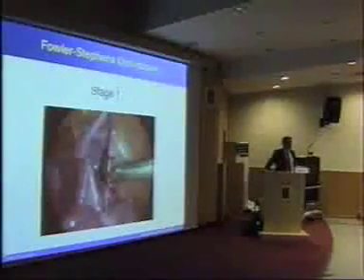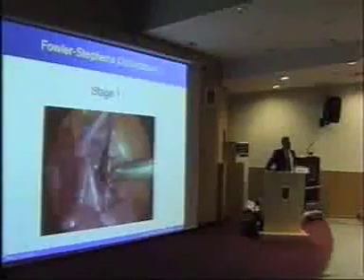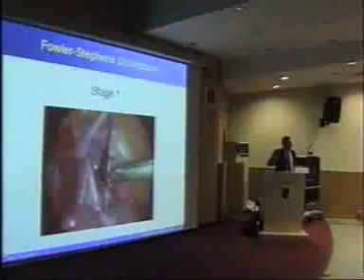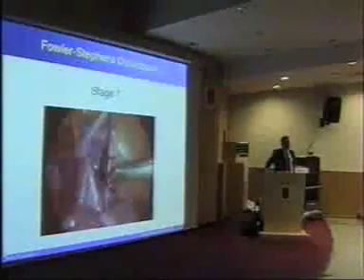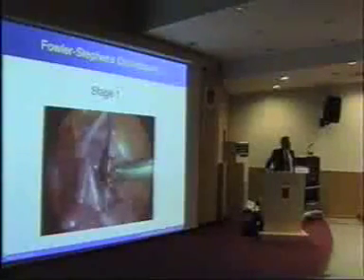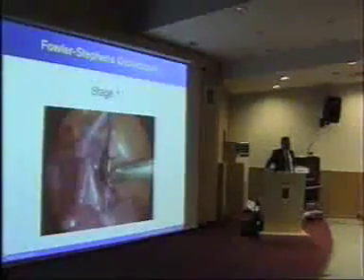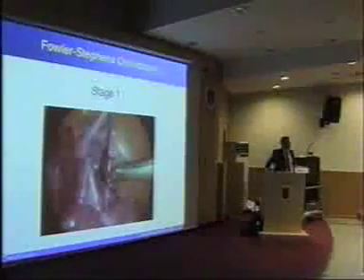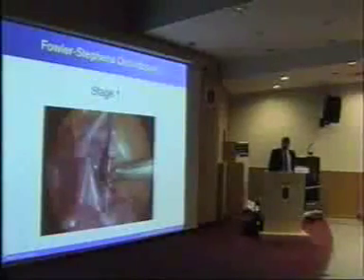But when you think about laparoscopy, it's very important to think about your first patient, who you're going to do it on first. And you perhaps need to find a patient who's having a laparotomy, for whom maybe a laparoscopy might be an interesting or a helpful thing to do in the first few moments of the operation. Or a patient in whom you're going to do an open procedure, like, for example, the equivalent of the surgeon's appendicectomy, where you just want to confirm a diagnosis or have a look inside first. And maybe the varicocele is a very good patient to do this in, because you can look, you can confirm the diagnosis endoscopically, you can check the anatomy on the other side, and then when you're ready you can go either to do the inguinal incision and do the high ligation, or you can do it laparoscopically.